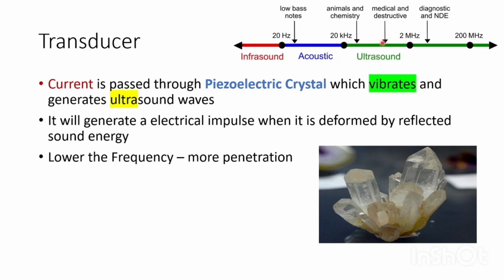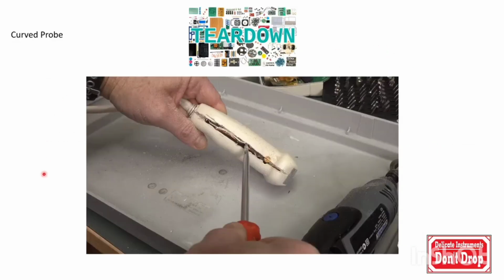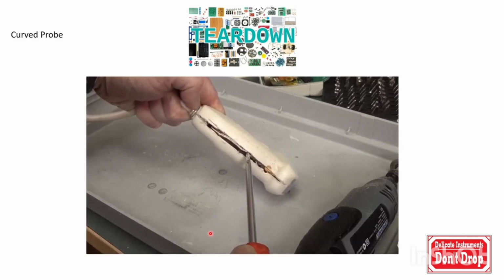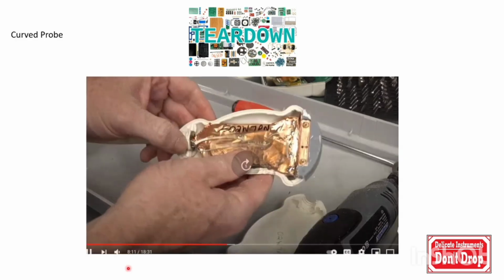Out of curiosity and interest, I'm showing a video of what is inside an echo transducer probe. This is not a cardiac transducer probe. This is a curved probe which we use for abdominal examinations, but fairly all are the same. In this video, this is a tear down video of an ultrasound probe.